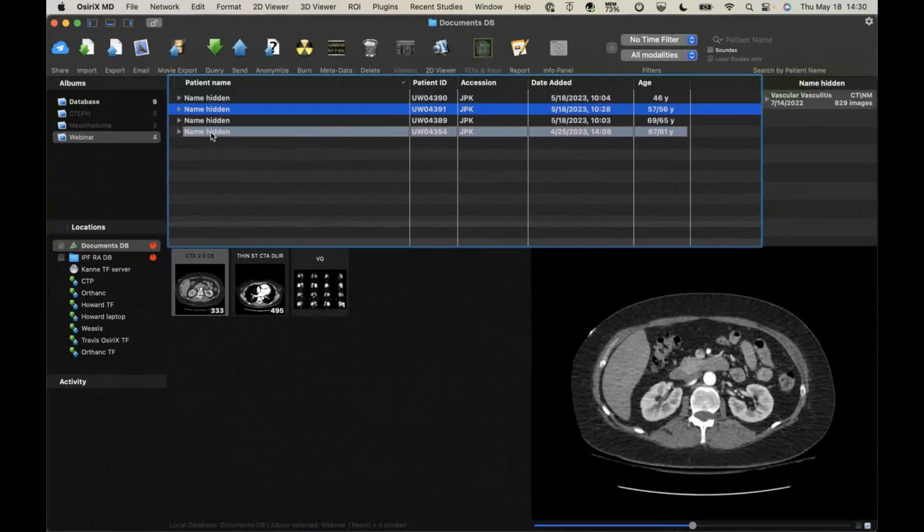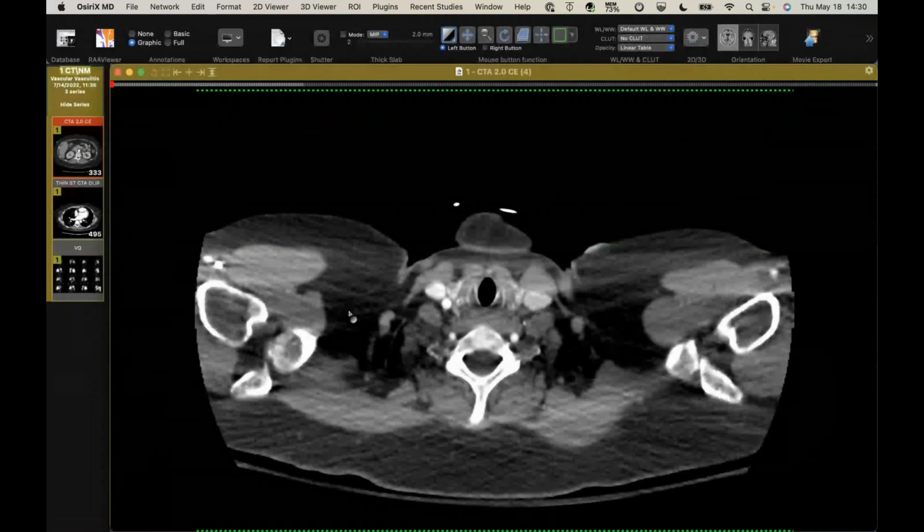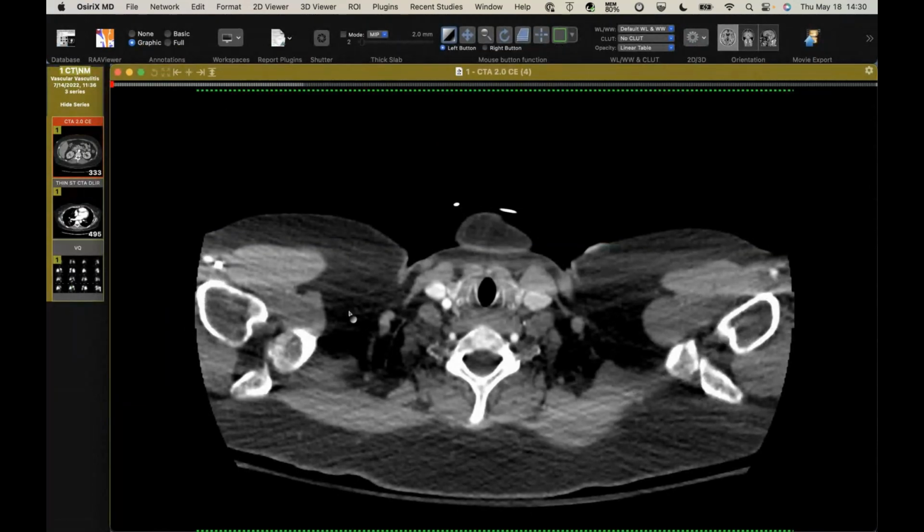Okay. And Jeff, you said that she was diagnosed before the age of 30, right? I don't know, but it was a while ago. I don't have all her imaging, but she established care with us several years ago. I only have imaging in the middle age time period, but presumably she's had it for a long time. And that may be why those lower lobes are out and didn't respond to therapy. But I didn't have anything from like 20 years ago to compare with.